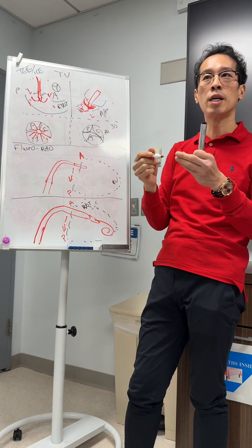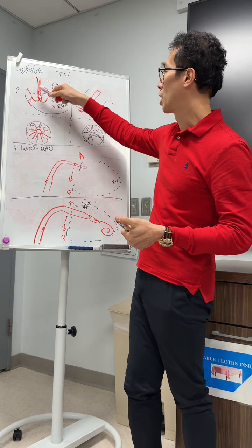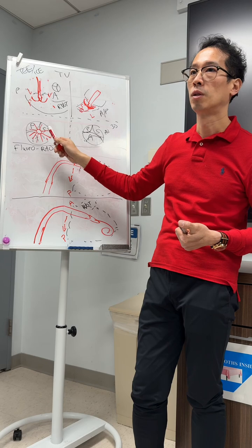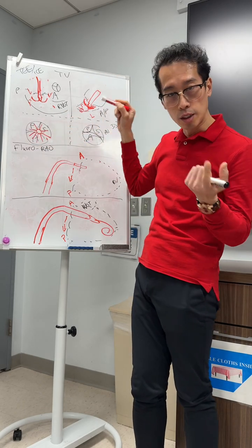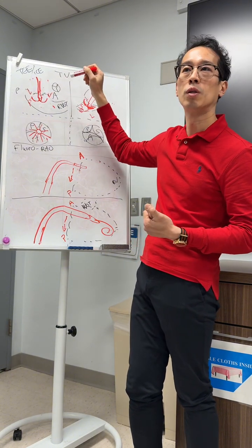Okay, so let's say there are 9 anchors being exposed, and you do your spin. You need to have a reference point in terms of this plane, and then this plane where you're starting off. You need to know where your commissures are. Now, at least in our practice, we always use this box because it's the highest resolution to look at the top right corner.